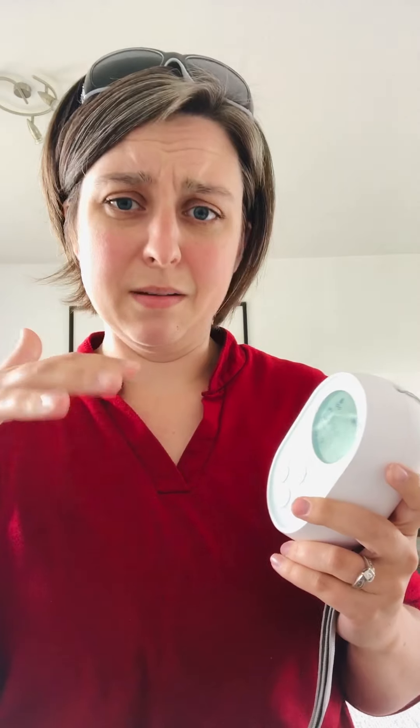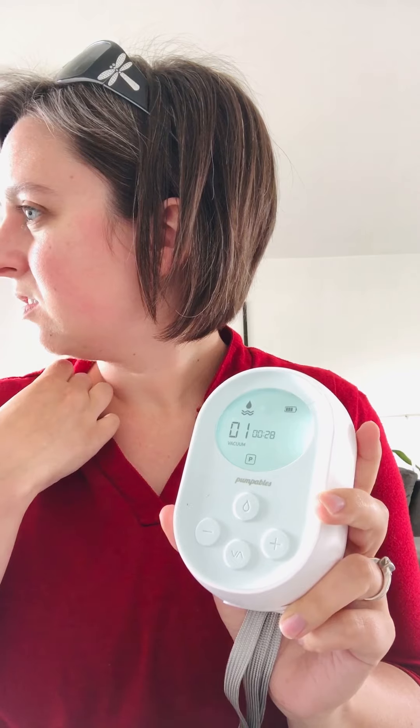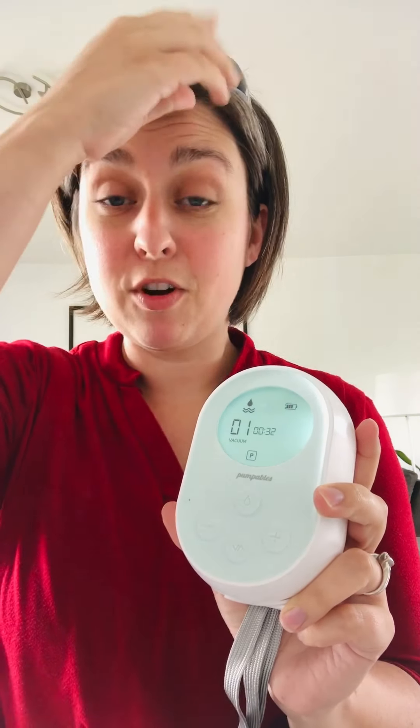You can use both of these on a battery, obviously, because they're portable pumps. The Pumpables Genie Advanced has a little bit more settings that you can customize. It also has a programmable feature — you can see the little 'P' on there — so you can program specific settings. I think this one may have had an app too, or maybe that was just the bigger Pumpables. Either way, you can create custom pump programs, which is kind of cool.